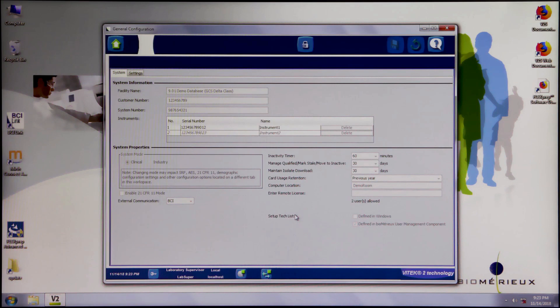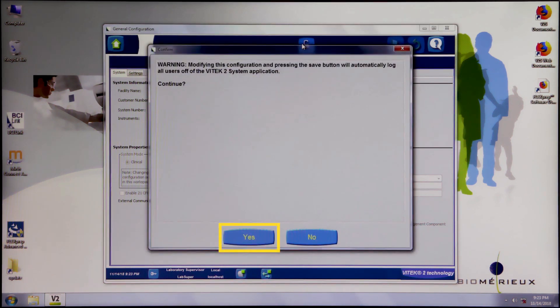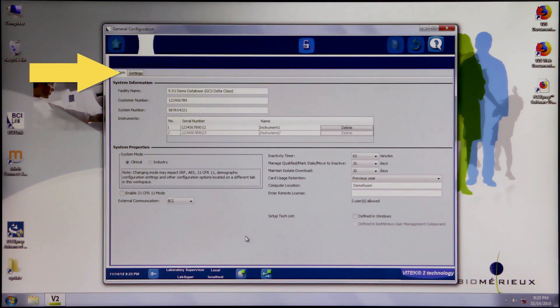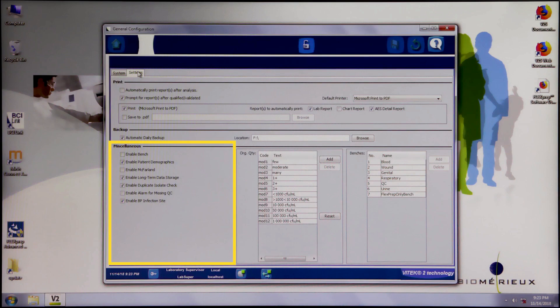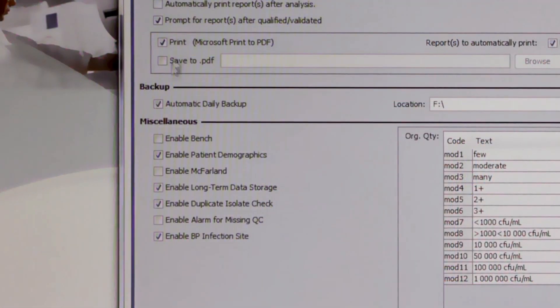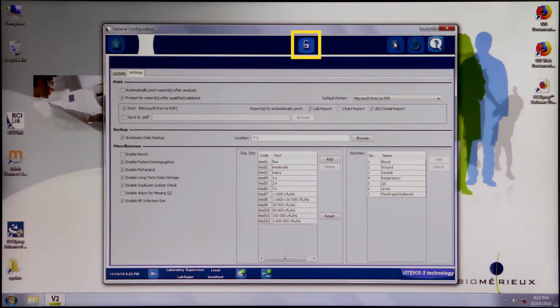In General Configuration view, click the lock/unlock icon at the top of the screen. Acknowledge the warning pop-up by selecting Yes. Click the Settings tab. Under the Miscellaneous section, select the Enable McFarland checkbox. Click Save, and then click the lock/unlock icon.